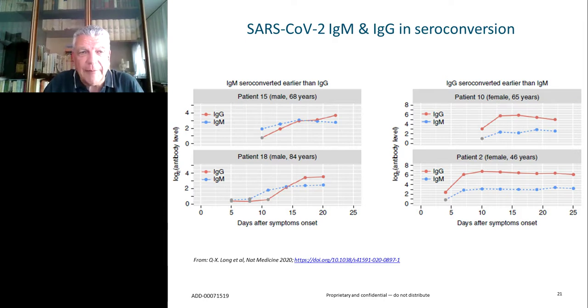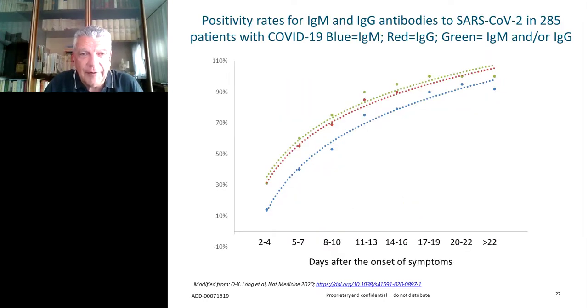If you wish to have a more comprehensive picture, we may revert to this kind of evidence that has been generated on quite a huge cohort of patients. This is the IgM line that raises over time and peaks at about 90% after 3 weeks. The IgG line peaks around 100% at the same time. And if you add the IgG to the IgM response, actually the gain is minimal, if any. So you attain the same level of sensitivity.